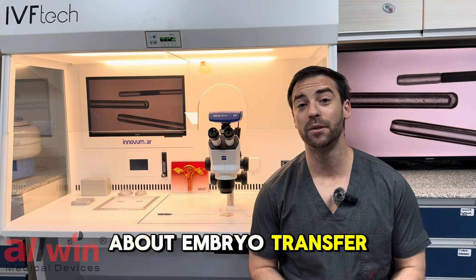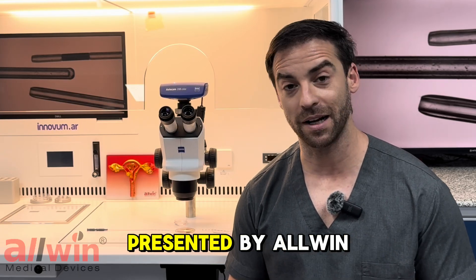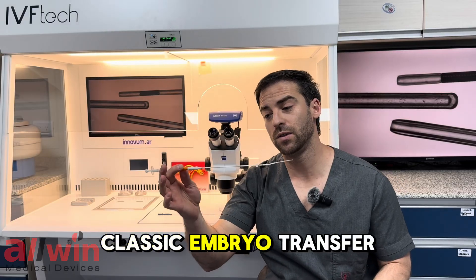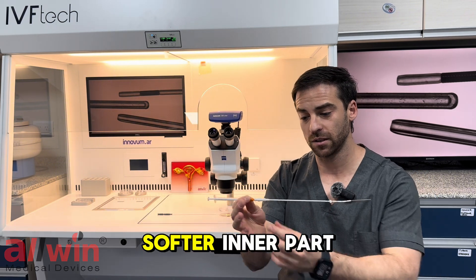We are here to talk about embryo transfer. I'm going to show you two different types of embryo transfer catheters presented by Olwen. This is a classic embryo transfer catheter with two parts: a more rigid sheath and a softer inner part.